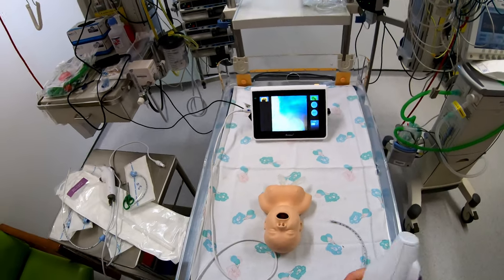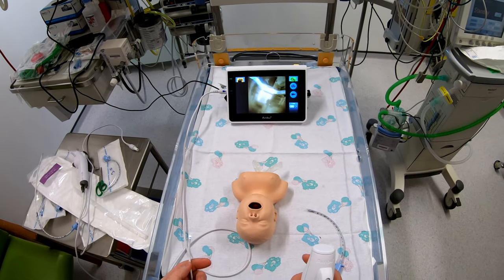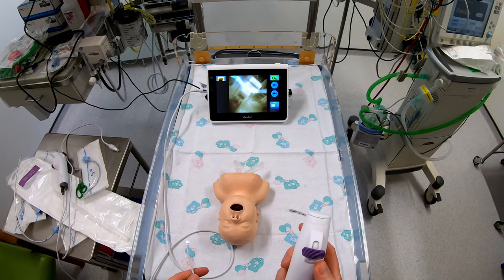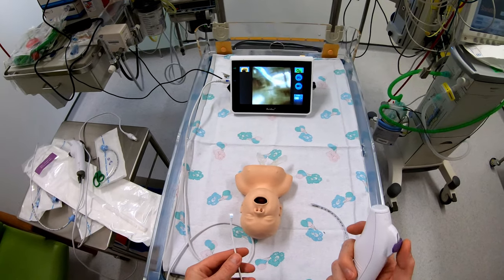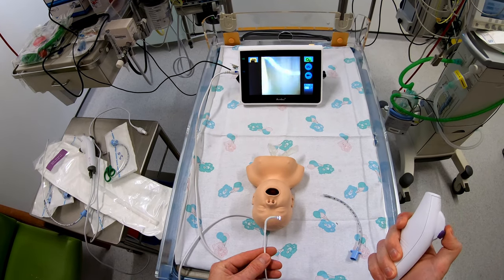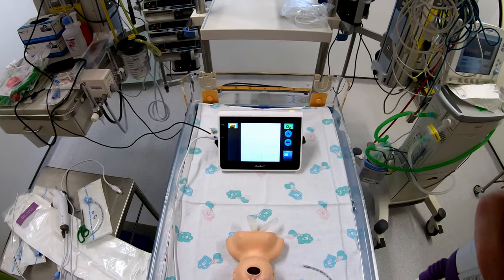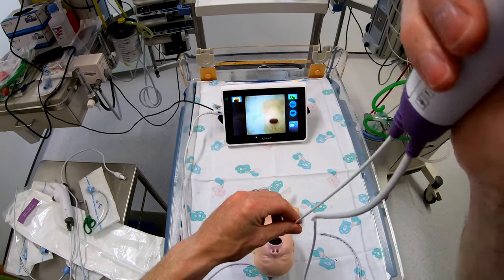Okay so that's it plugged in. What you'll notice is there is no working channel on the device and no way to suction with it, so it's just fairly simple controls. There's an up and down button, but you can see there's a pretty good range of movement off the tip of the scope. We're just going to insert it into this model and have a look at the image quality.